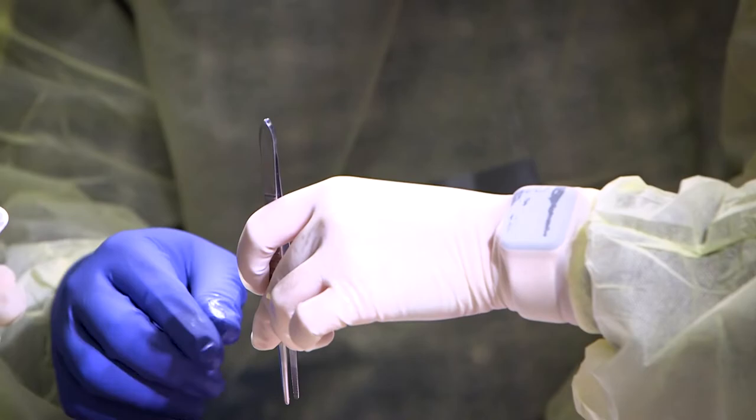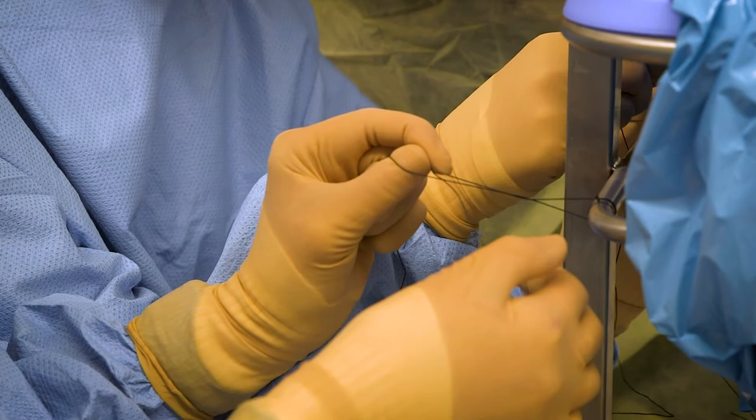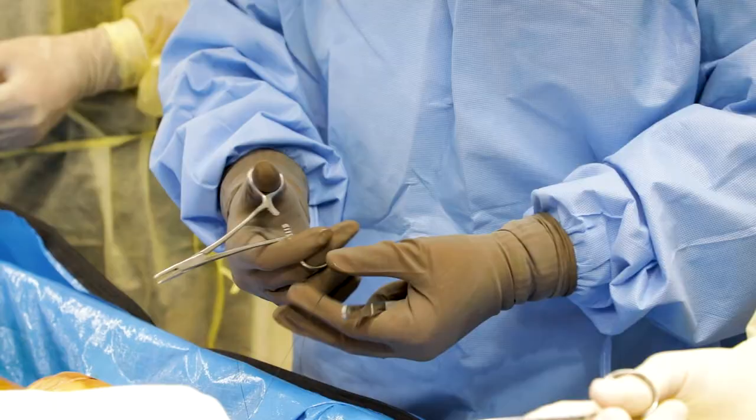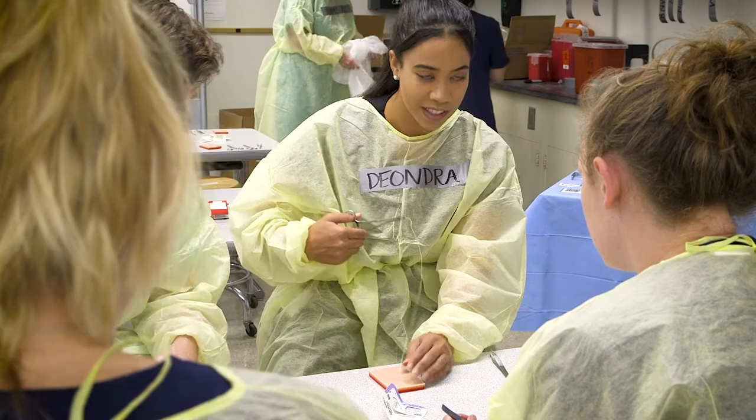So far I've worked with close to 20 people. It's exciting for them to also know what type of stuff we do, and they appreciate the technique and the training we're giving them. I've been helping out with hand tying and suturing on the donors, showing them the two main sutures we really work with: the intercuticular and the simple interrupted.